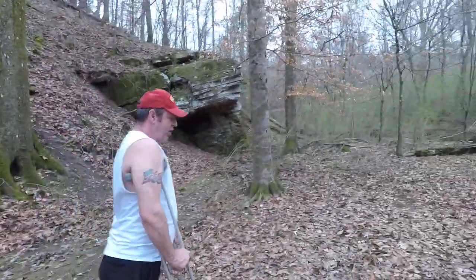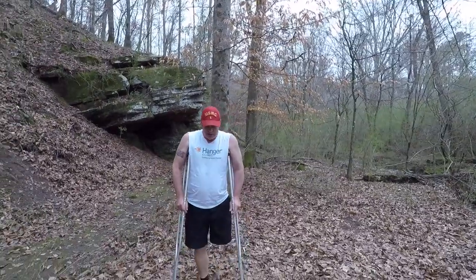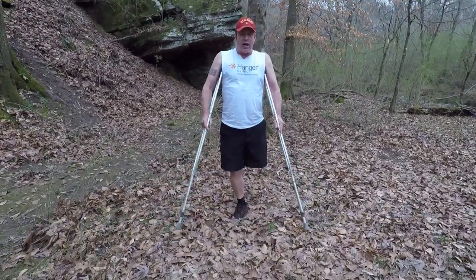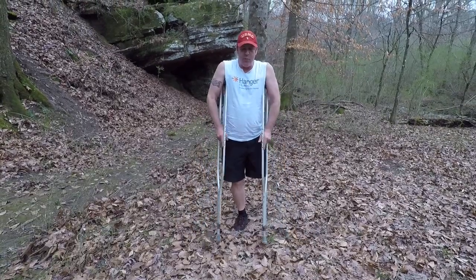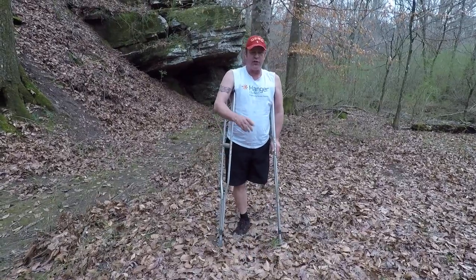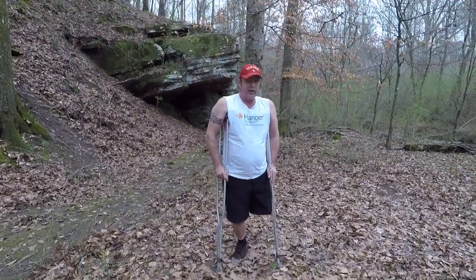Before I go any further, one of the things I wanted to show is that when I'm walking, I'm not walking with my crutches way out. I'm actually walking and doing kind of a circular motion, bringing them in. That way it doesn't catch on vines or stuff, and I'm also a ground watcher. So here we go.